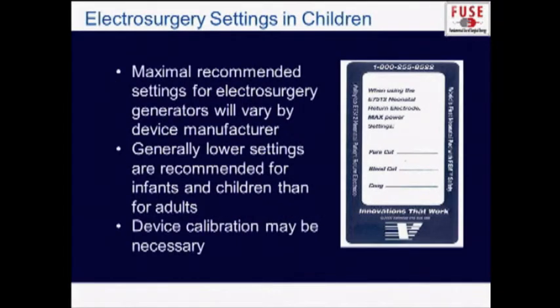All right, electrosurgical settings. The one reason that I actually volunteered to give this talk way back when we were starting Fuse is that I wanted to know, what should I be setting my devices at? I've never seen that written down, and nobody's actually instructed me to that. I will say that there isn't any pediatric surgical literature on this, and as you've heard throughout the session, you want to try to use the lowest settings that you possibly can to get the desired thermal effect.